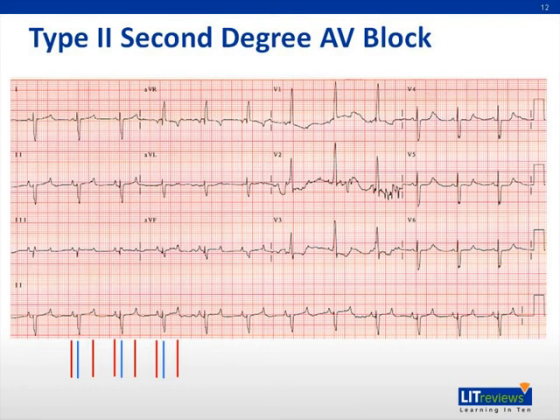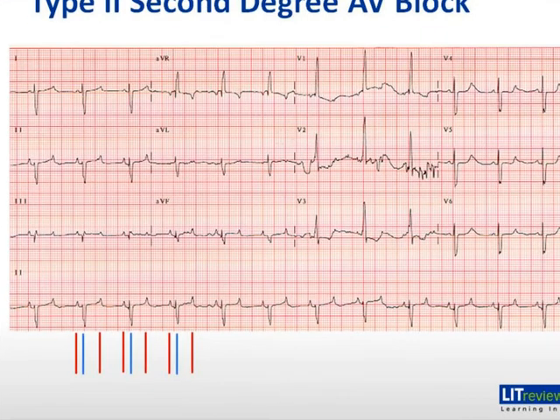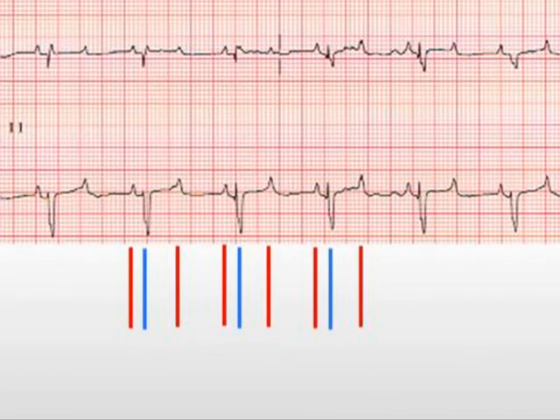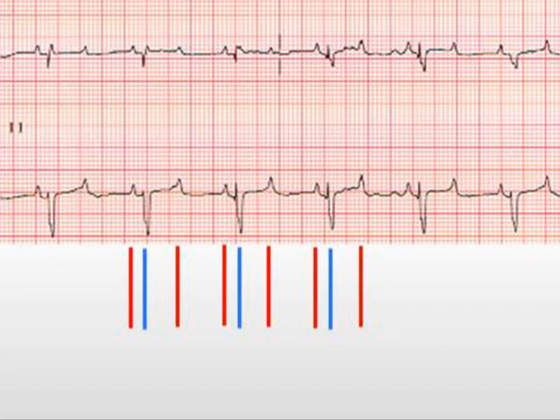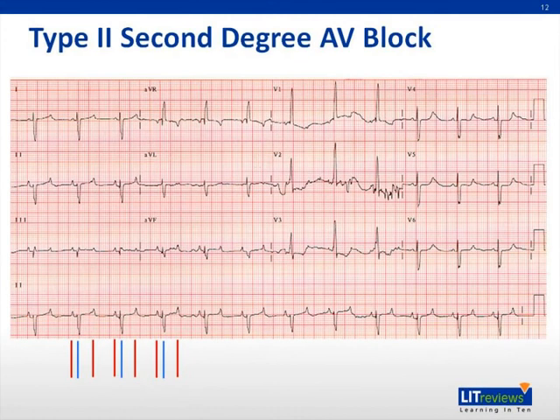This is a 12-lead ECG of a patient with type 2 second-degree atrioventricular block. Looking at lead V1, there are two P waves for every QRS complex. The second P wave is accompanied by a QRS complex indicating appropriate AV conduction, but the next P wave is not associated with a QRS. Red vertical lines represent P waves and blue vertical lines represent QRS complexes — there are twice as many red lines as blue. The distance from red to blue lines stays constant, representing a constant PR interval, and the distance between blue lines is also constant. This patient is diagnosed with type 2 second-degree AV block with 2-to-1 conduction.